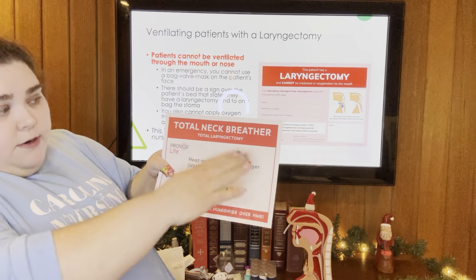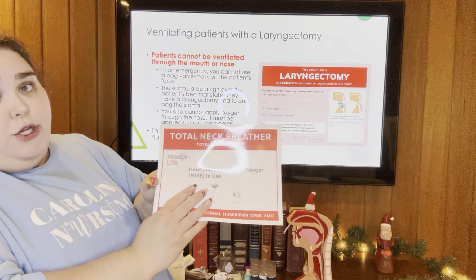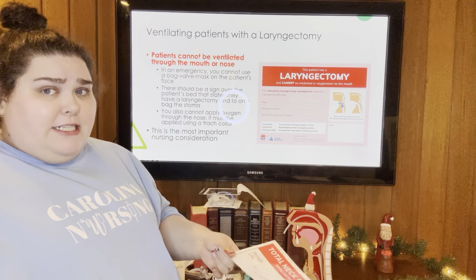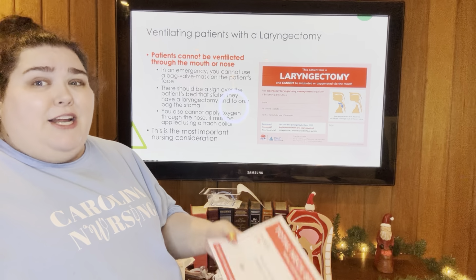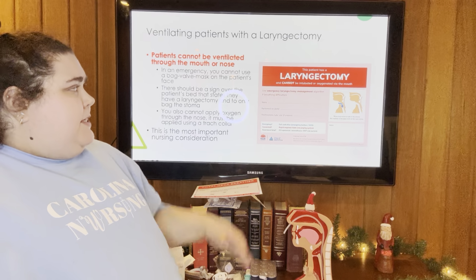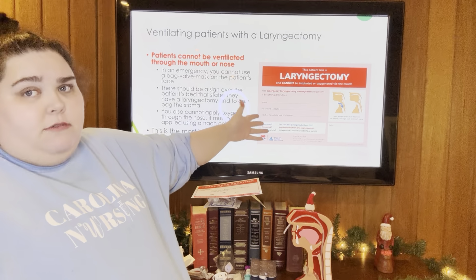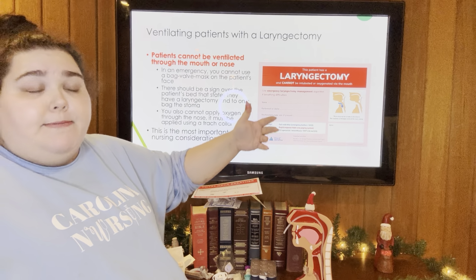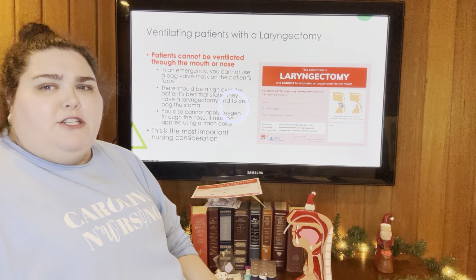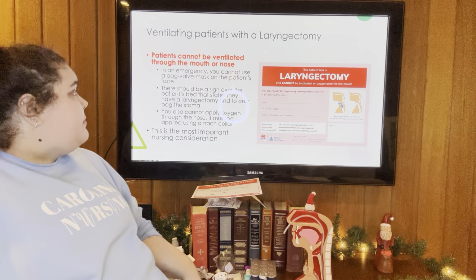So see, total neck breather, total laryngectomy. This one says that they have an HME valve in use. That is important because if you were to need to intubate them or bag them or anything like that, you would need to remove that. So also important to note. In the case of this one, they just have some information about the laryngectomy tube on this card as well. So it has other information that that patient might need to know. But it depends on your hospital what those look like.